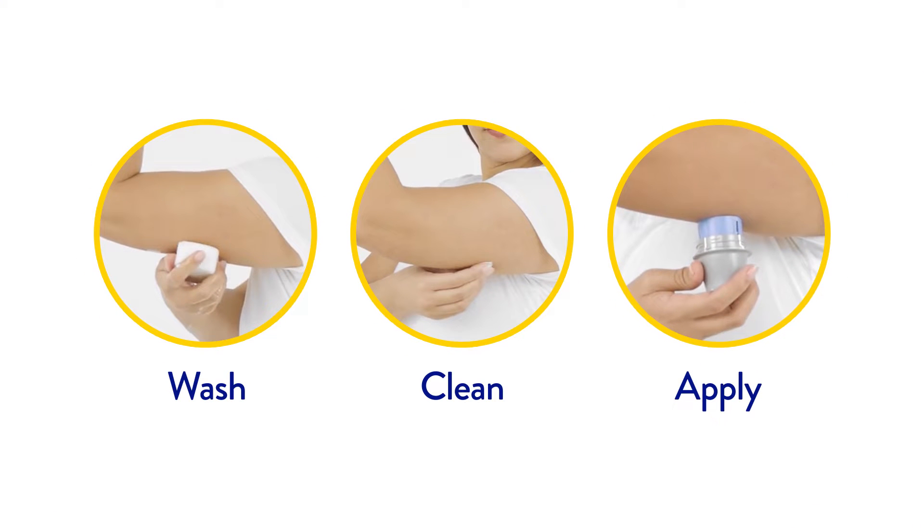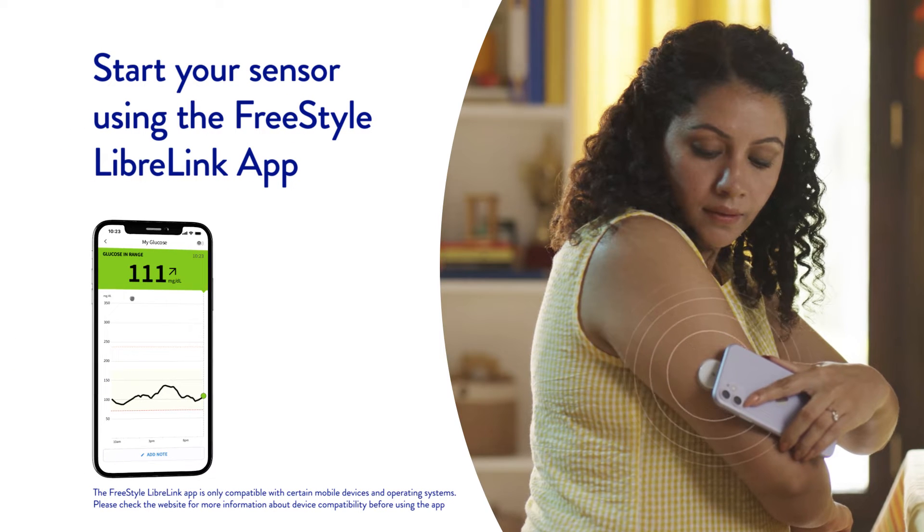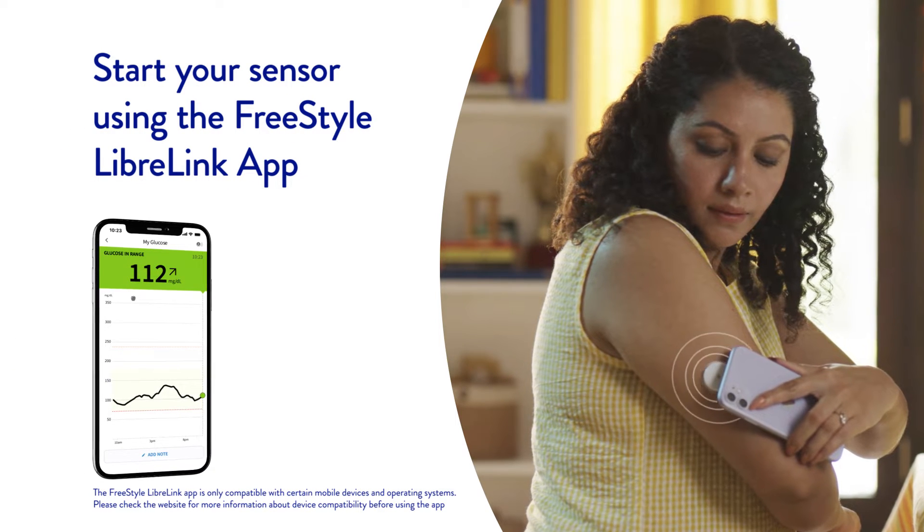Once you have applied the sensor on the back of your upper arm, you can start your sensor by scanning it with the Freestyle LibreLink app on your phone. You have to wait 60 minutes before your sensor is ready for scanning.